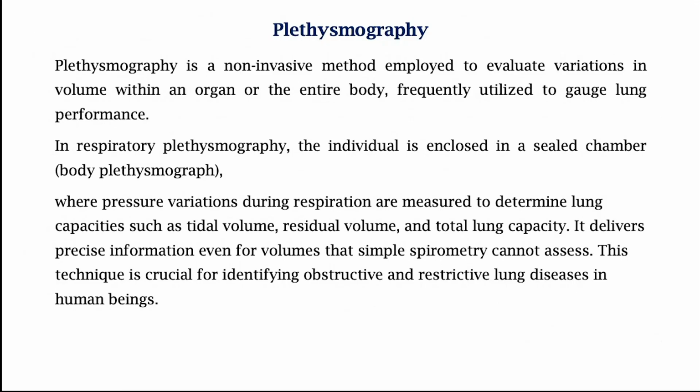Now, but how? What is the fundamental principle? Imagine you are sitting in a phone booth, which is essentially the plethysmography chamber in which you are measuring. You are sitting in a tightly sealed phone booth, and you are trying to breathe. When you inhale, your chest will expand. That means the volume is increasing. But where is this air coming from? From the rest of the phone booth? No, because it's tightly sealed. Well, it's extraordinarily difficult to seal a phone booth. I understand. Let's assume that you are able to seal a phone booth.